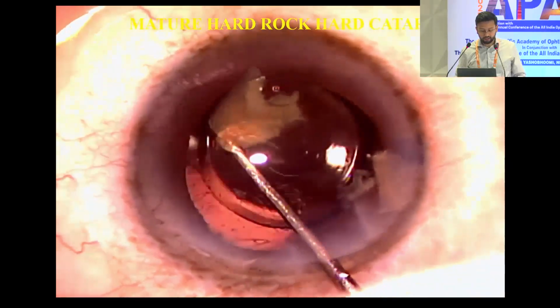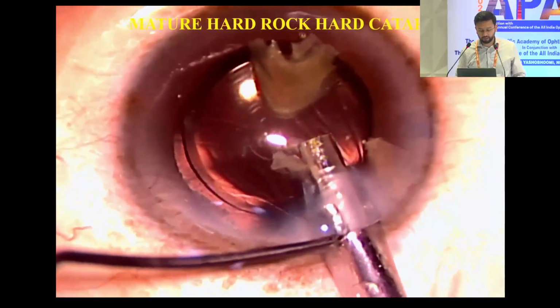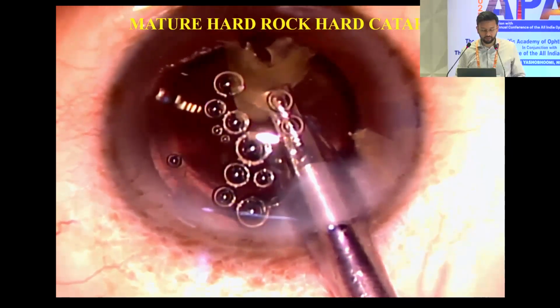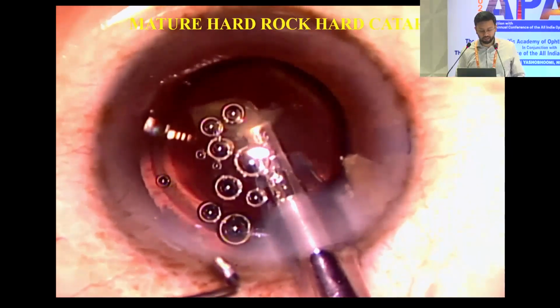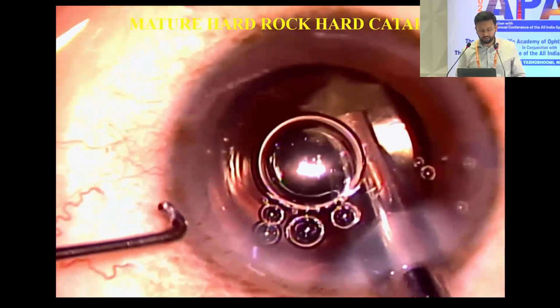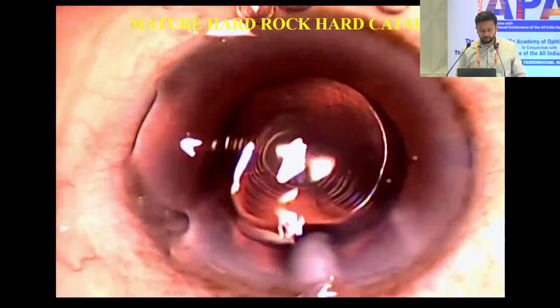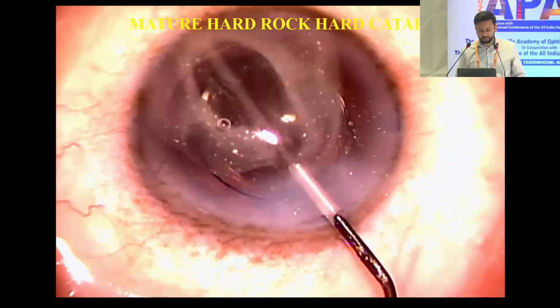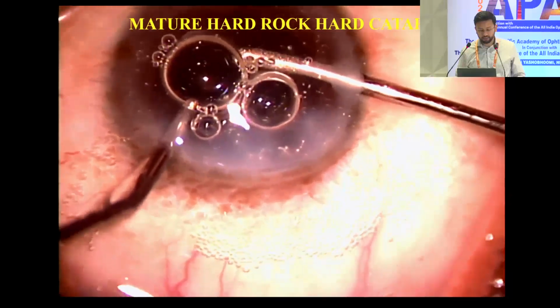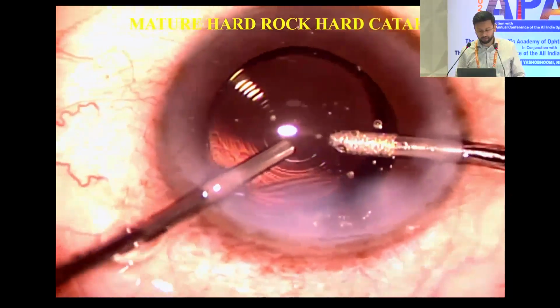And here in this case, the IOL also acts as a scaffold to hold the vitreous back, and also as a base to emulsify the rest of the fragments without loss of any fragment into the vitreous. So here we were able to complete the case with good visual outcomes. Of course, we have to ensure that there is no vitreous in the AC by staining with the triamcinolone crystals.